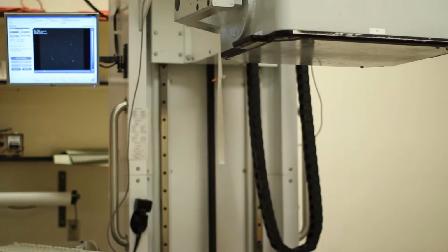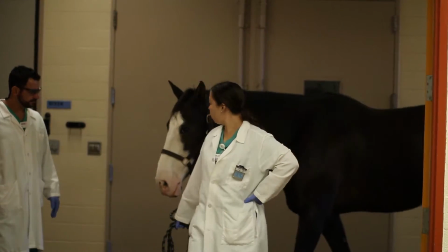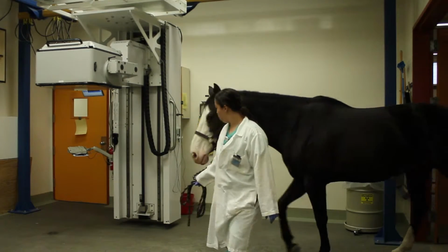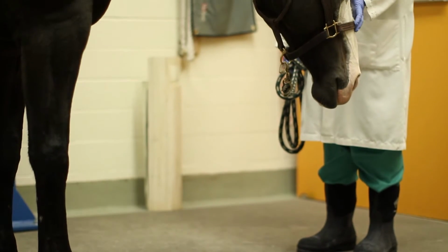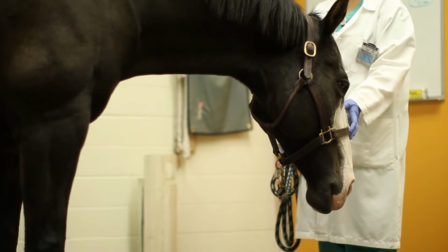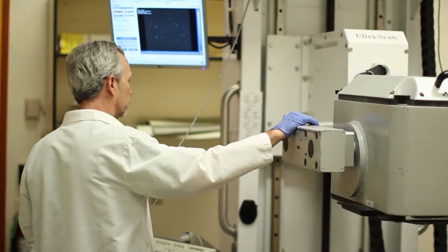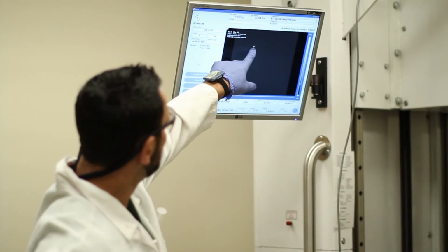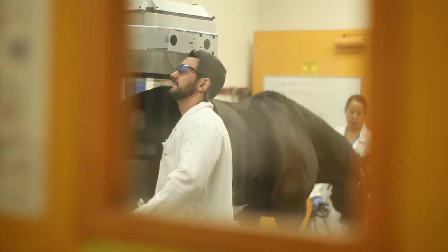Nuclear scintigraphy is a very different imaging modality from most of the others. While it does provide some anatomic information, what's most interesting about it is the ability to define function of different tissues. That might be the thyroid gland, it might be regions of blood flow, it might be areas of very subtle bone turnover, either small fractures or, in the case of cancer imaging, that might include metastases to bone that are not detectable in any other way.